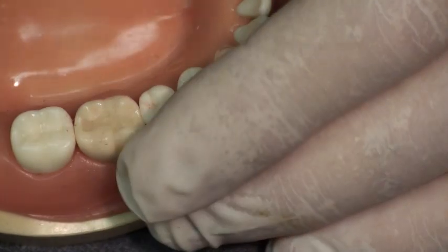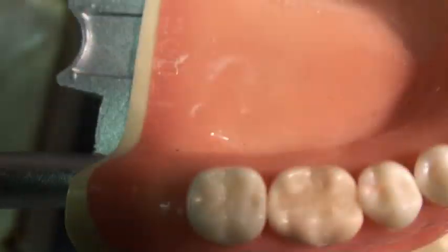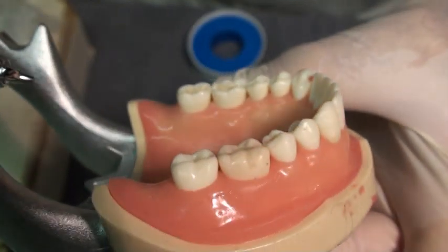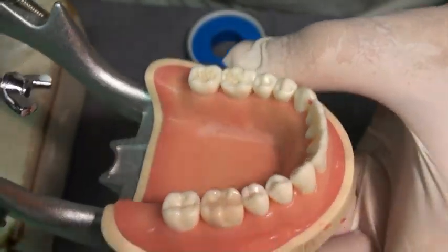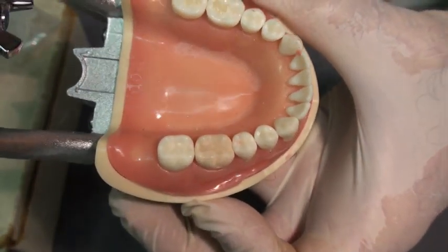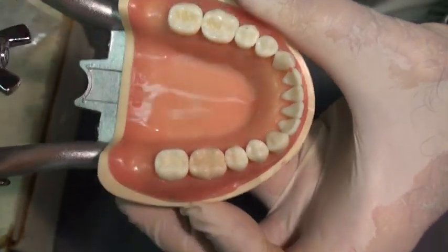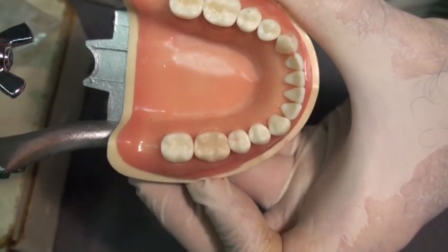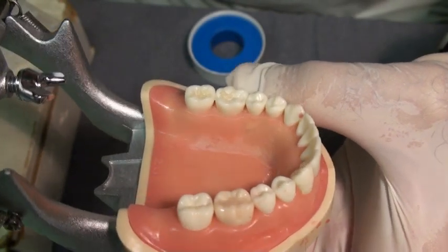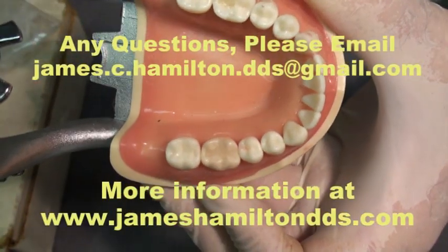I would just cure it again for 20 seconds — it's the recommended time for this composite — and this patient most likely would be able to get up and walk out of the chair with minimal shaping, finishing, or polishing.